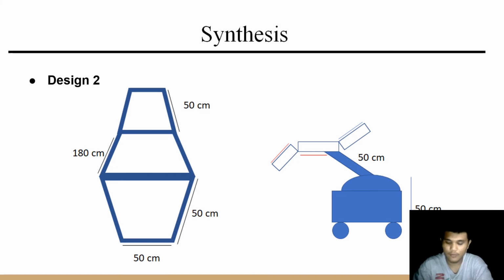This is design 2. On the left side, we have the structure design of the chair. The design is the same as, or we can say inspired by, the dentist chair. Here, we have the upper section, middle section, and then the lower section. Also, on the right side of the slide, I put a bigger view of the chair.